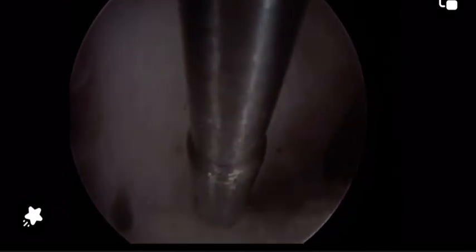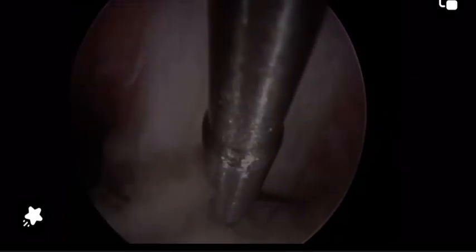So in this video, we will share together the technique of using the scissors to cut and release the uterine septum. Stay tuned, watch, and more tips and tricks to master intrauterine surgery.